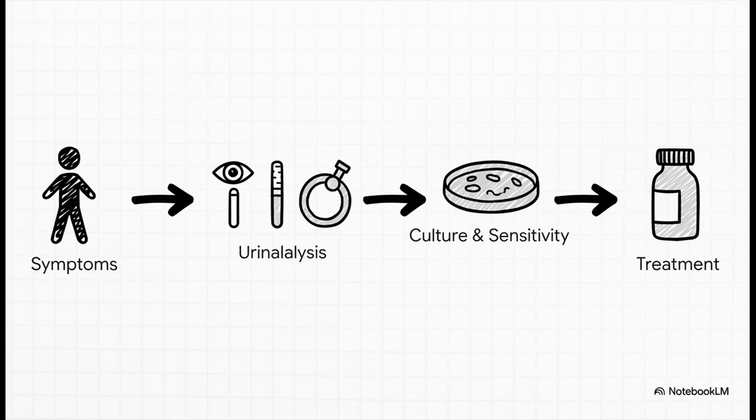We started with the patient's symptoms, we used the complete urinalysis to confirm an infection, and then we used the culture and sensitivity report to pinpoint the exact cause and find the right medication. This is a perfect example of laboratory medicine in action.